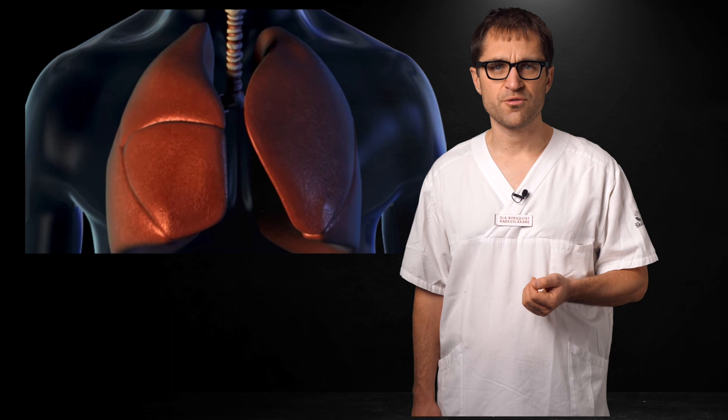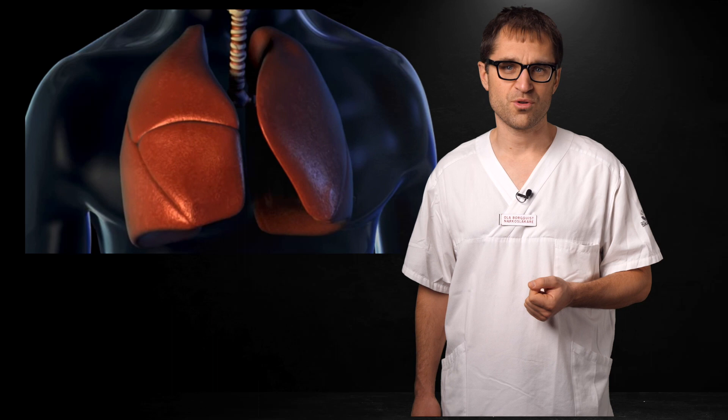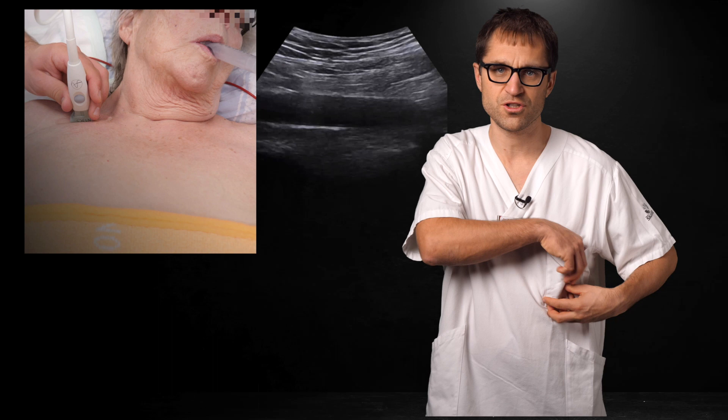A word of caution: patients at risk of pulmonary edema may actually be pushed over the edge with this maneuver. An increase of the intrathoracic pressure causes venous congestion — it's like placing a tourniquet on the central vessels. You can achieve this by having the patient perform a Valsalva maneuver. However, our experience is that this is difficult in clinical practice as the patient moves around too much. A more elegant and controlled version can be achieved by removing the plunger from a 5 or 10cc syringe.